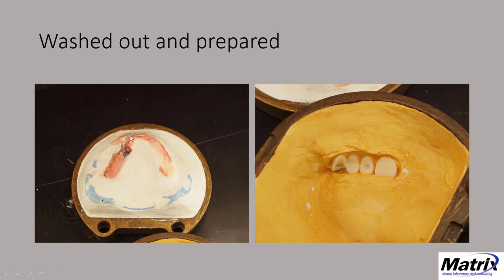You'll notice that I have this little liquid latex. This is a rubber sep. And the reason I put that on there is because when I opened the flask after I washed it out, I had a little bit of a catch, and I got like a little fracture line right here in the top of the first pour. So I covered it with that product so that I wouldn't have any acrylic stick in anything or get jammed down in there around the teeth. But what is exposed is the shaft and the saddle, and that's all washed clean.